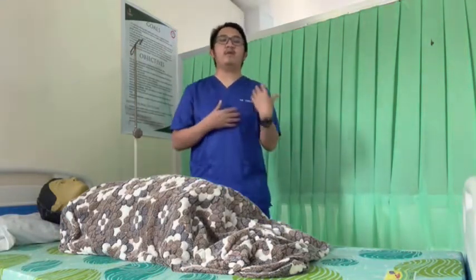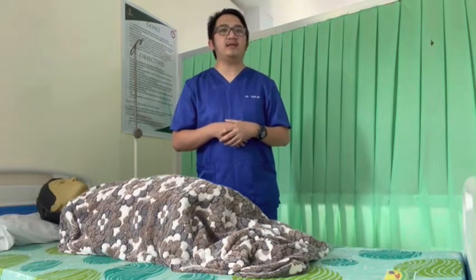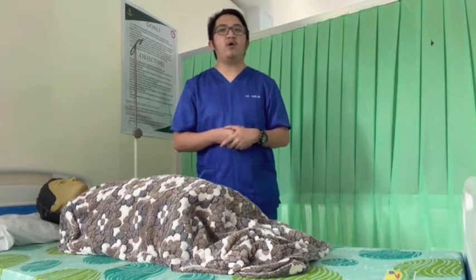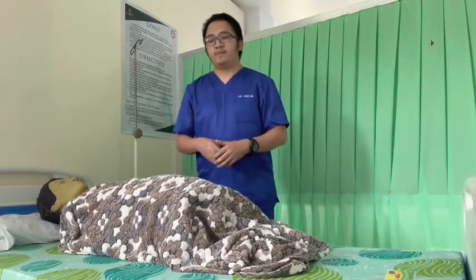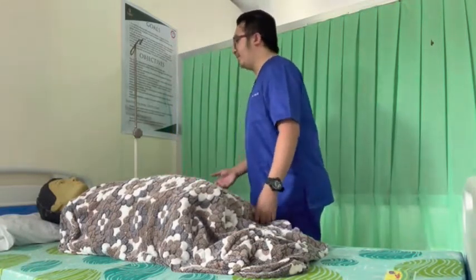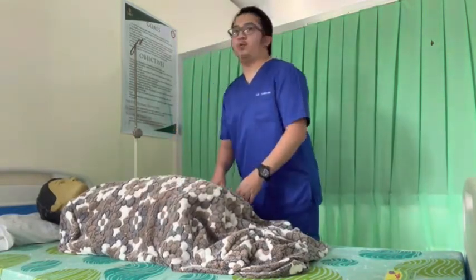Assuming that I've already checked, explain the procedure to the patient and describe the sensations they are likely to feel during the procedure. For instance, a sensation of cold as the site is cleansed with a solution, and a needle prick when the local anesthesia is injected, to gain the patient's cooperation and reduce anxiety. Okay, sir, I'll be recording your observations. Assuming that you will feel discomfort in your spine.